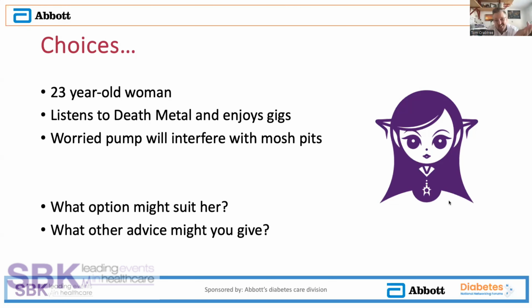scenario. But the other thing is, as long as she's using the pump the majority of the time, she's probably going to get the benefit. So it's not unreasonable to say, well, why don't you choose to go onto a pump? But if you know you've got a death metal gig planned, where you're going to attend and want to be involved in a mosh pit or a wall of death, you could switch to pens for the day and get yourself back onto pump safely the next day. So that is another option to think about if that encourages them, because then they'll still be getting the benefit the majority of the time, but it allows them the flexibility to continue to enjoy the things that they do in life that perhaps having a pump, any pump, would interfere with. So worth bearing that in mind.